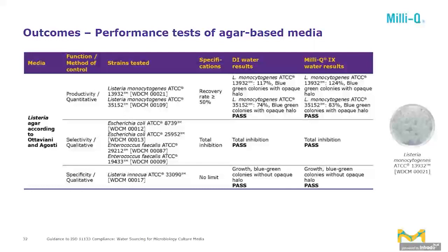This is an example for a solid medium and a special medium, a chromogenic and selective medium. So it's a really sensitive medium for the preparation, and we expect to see it if there are any differences in the water quality.